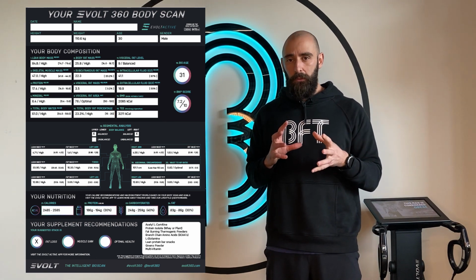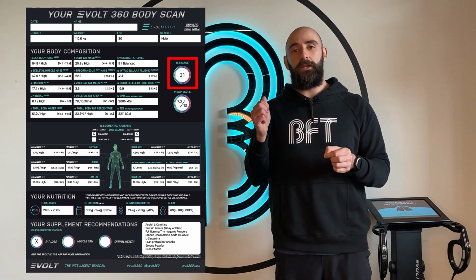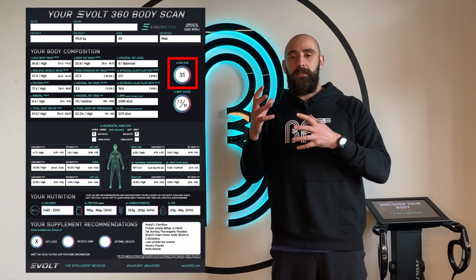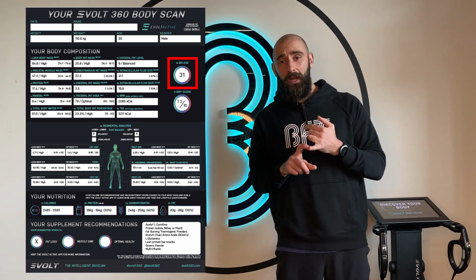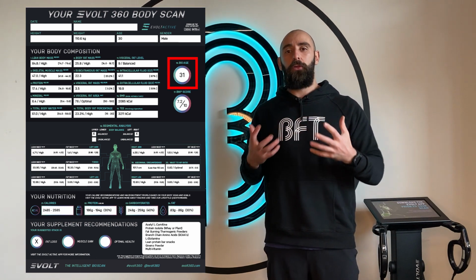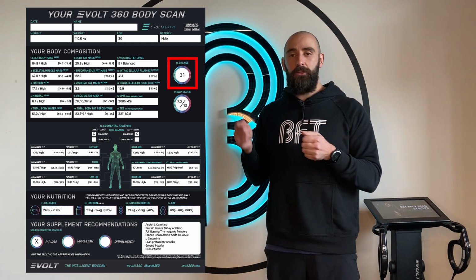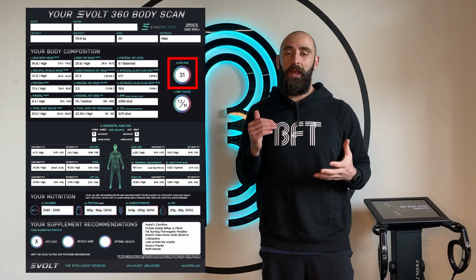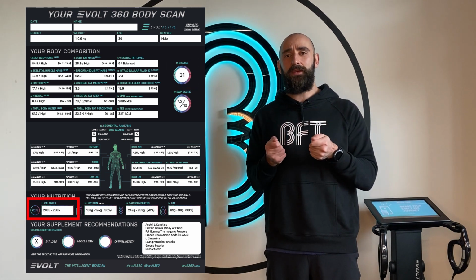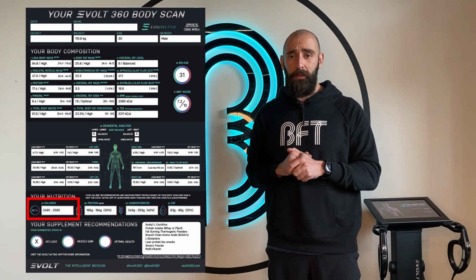A couple other things we want to look at is the biological age on our scans. So with the biological age on the scans, it's going to take into consideration, yes, our chronological age, so how long I've been on this planet, but it's also going to take into consideration the health of my organs, the health of my body. And yes, I'm 30 years old. When I do my scan, I ideally want my biological age to be less than 30. So when we're looking at our scan, that's going to give us a really good indication of what stream to fit in. So whether that's stream A, stream B, or stream C, or whether it's the two plant-based streams.